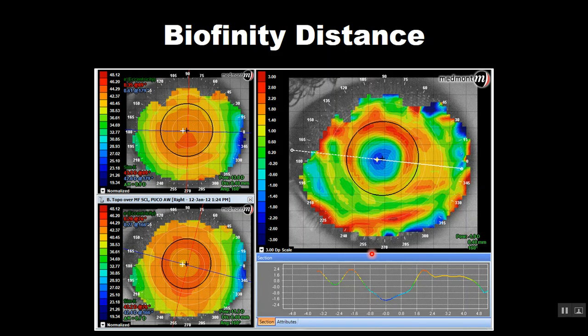Now, if you take a multifocal soft lens and do topography over the naked cornea, over top of the soft lens on eye, the multifocal lens on eye, you see that differential. Minus in the center on the visual axis, plus toward the periphery, creating that minus center plus periphery. Less power on the fovea, more power in the periphery.